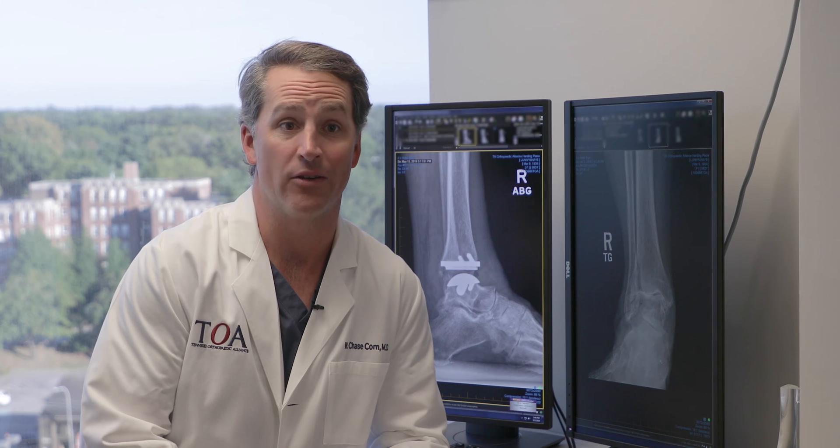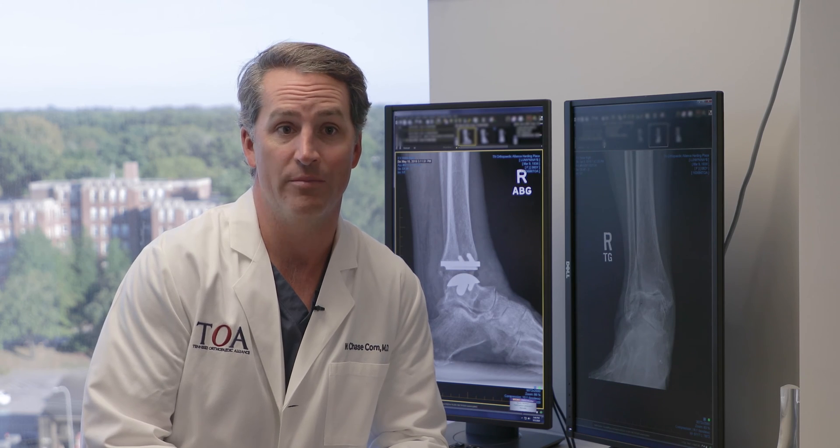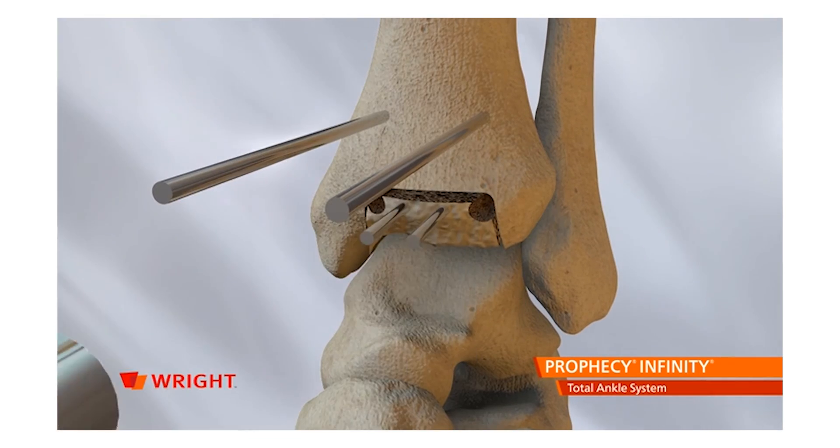I'm Chase Corn. I've been here for six years and I'm an orthopedic foot and ankle specialist. A total ankle replacement is a surgical procedure where we take an arthritic ankle, remove the damaged bone and cartilage, and replace that with metal and plastic parts to help retain the motion of that joint.